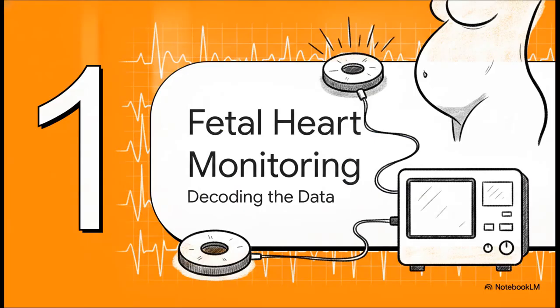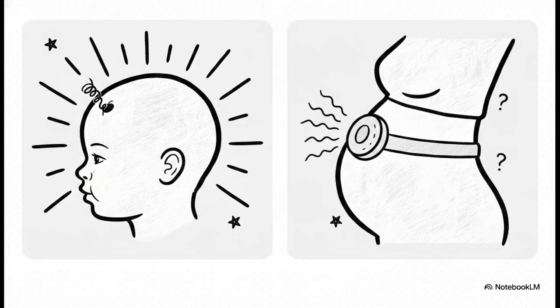All right, Section 1, Decoding Fetal Heart Monitoring. Before we can even try to read the monitor, we need to know how we're getting this data in the first place, right? It doesn't just magically appear. We basically have 2 ways to do this. First up is internal monitoring.